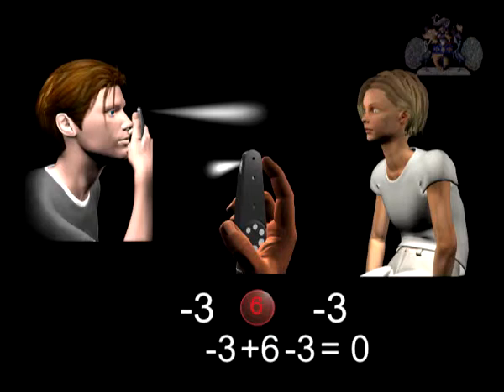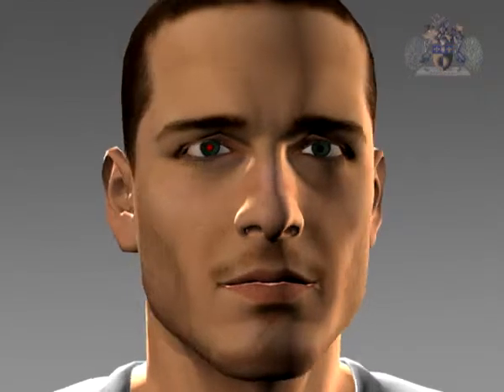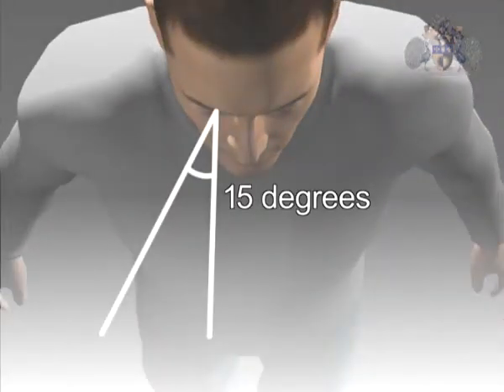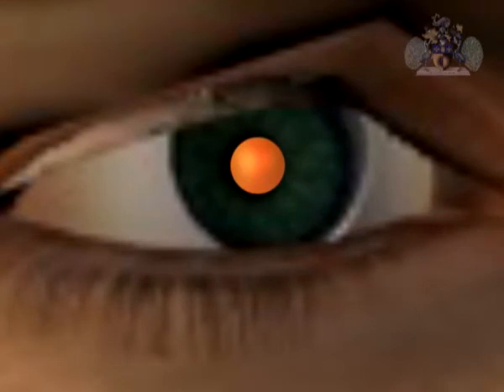It is often the case that the patient is unaware of the strength of their spectacles. This is where it is important to get one's position right so that despite the fact that the image is blurred, if the examiner is in the right position at 15 degrees to the nose on the horizontal plane, then the view is bound to be that of the optic nerve, however blurred this may be. In this correct position, the ophthalmoscope dial is then rotated until the image becomes focused.